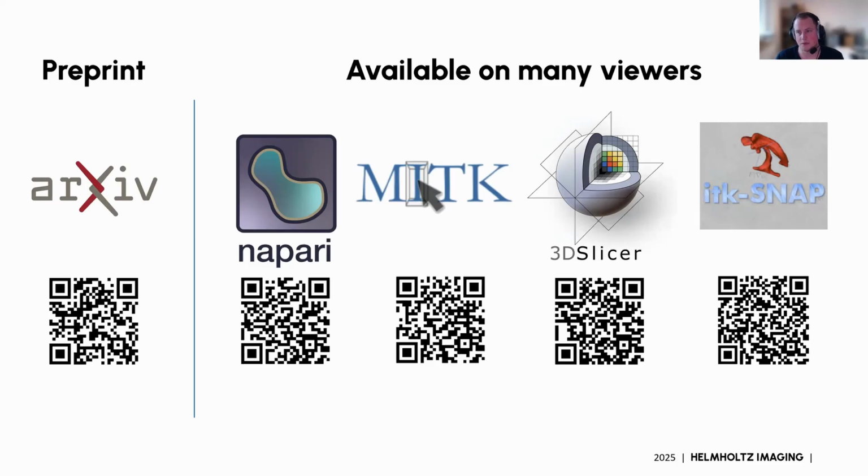If you're starting out, I would recommend you try MITK or Napari, because these were the ones we were directly influencing. The others were built by the community and may deviate in the implementation from how we did it ourselves. And it also depends a little bit on your setup. nnInteractive really needs a local GPU, because CPU is way too slow.